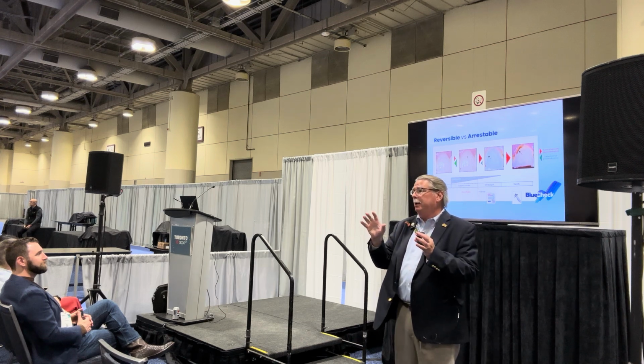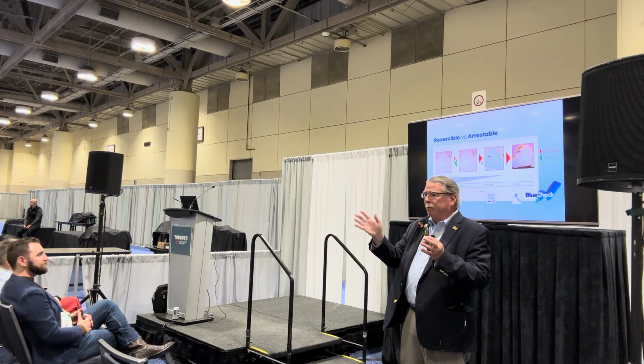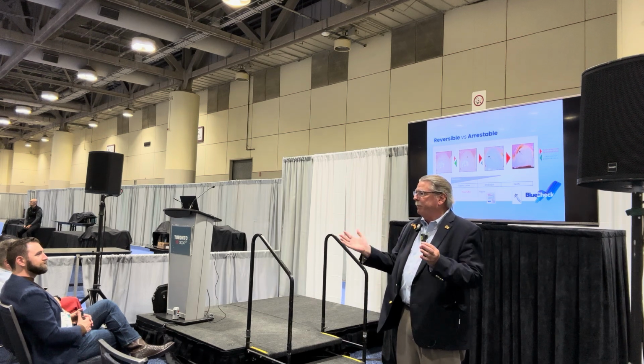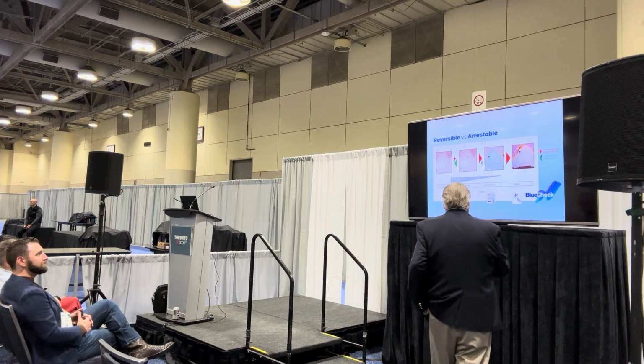When you put it on porous enamel, D-min enamel, it will turn blue. And it will be a lighter blue if it's reminning. And so you can take a picture all along the way and have it in your data bank, and you know exactly where you're at. So I like that.